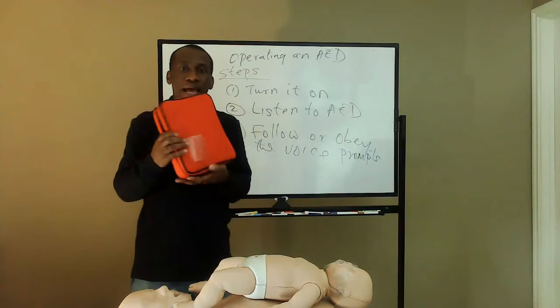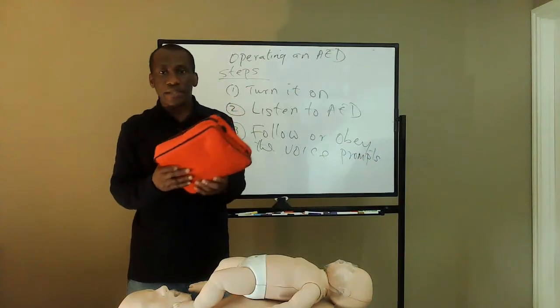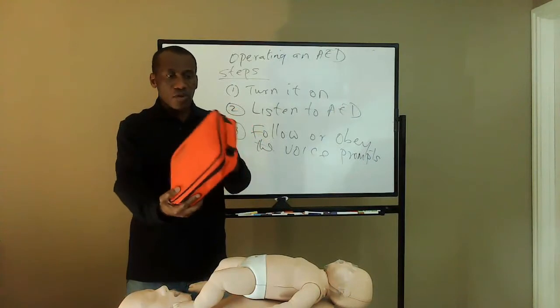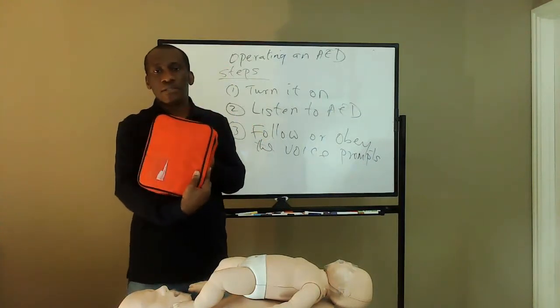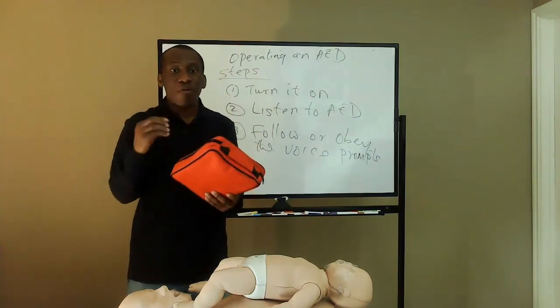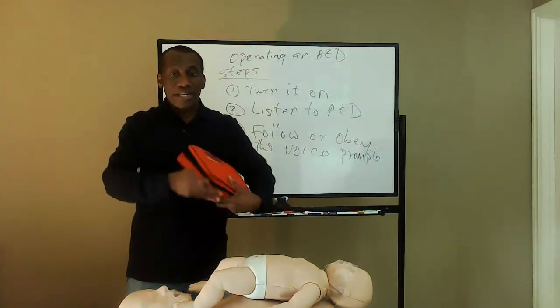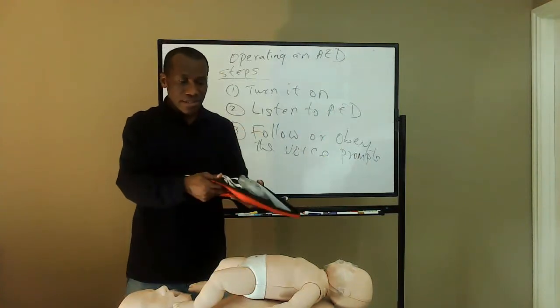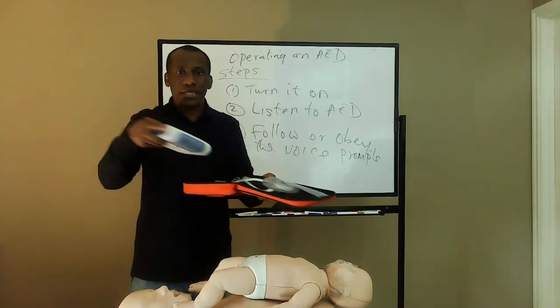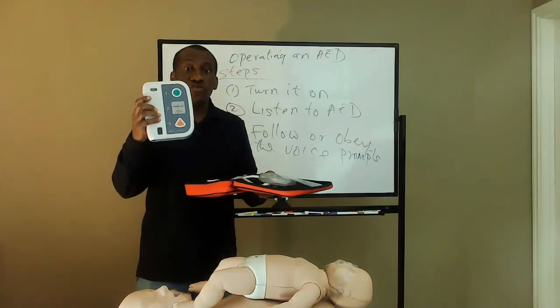This is the AED I have. There are different AEDs out there. This is for training, so it will not be able to give the actual shock. It's a portable device, very lightweight as well, but it is computerized. But it does a powerful thing, something that is unimaginable. So this is the AED itself. You need to familiarize yourself with the AED that you use.